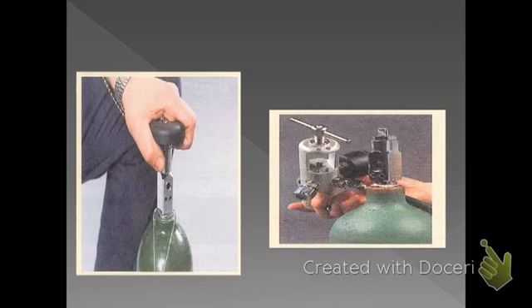So now that the O-ring is in place, the next step would then be to clear. We're going to say clear the oxygen tank. And so what does that mean? It means to turn it on and just let some oxygen flow before we actually attach the actual pressure regulator itself. In step number 4, what we want to do is attach the pressure regulator.